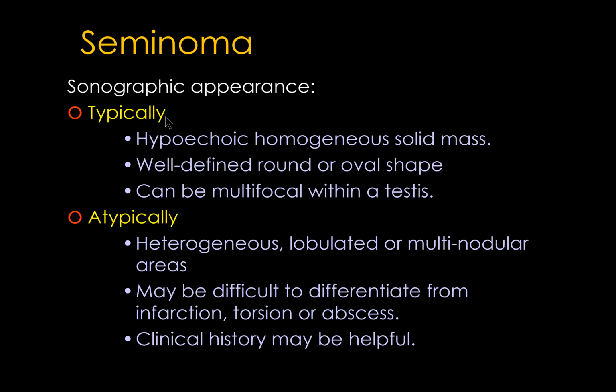This is a small seminoma with the typical characteristics and appearance: homogeneous, hypoechoic, and well-defined in some areas, and most commonly, in most areas it is well-defined.